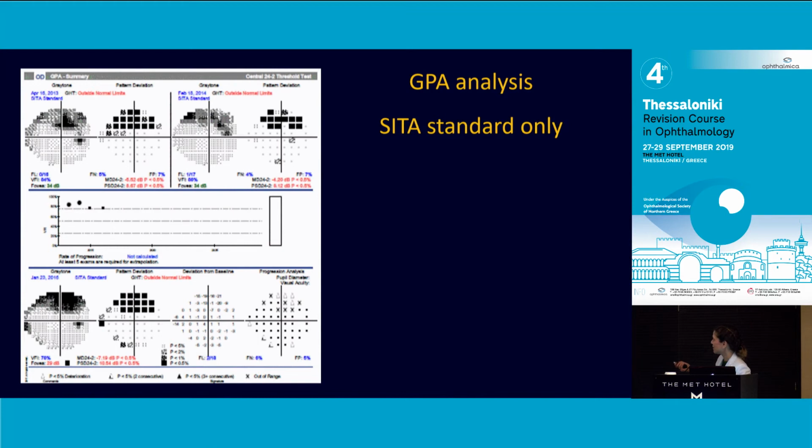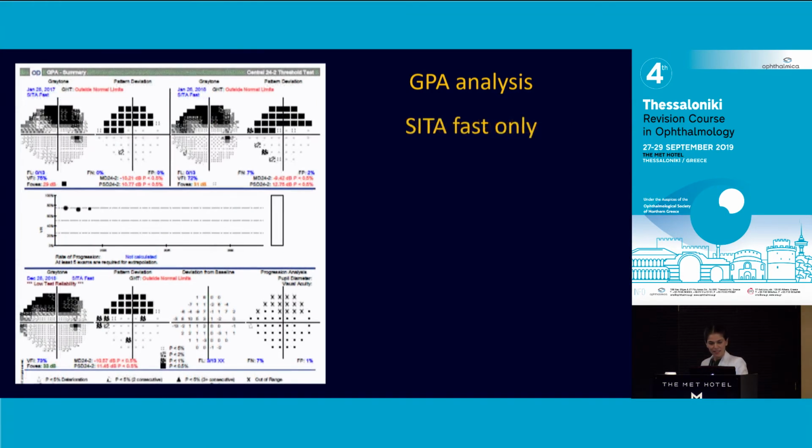So this is a relatively flat line here, nothing highlighted when I separated the fields, and again, nothing here. The patient, though, because of her family history, was saying, I'm getting worse, my vision is getting worse, and I was a little bit affected by that. I didn't do anything, but I decided to watch her a little bit more closely, because somehow I just didn't like how the field looked. But this is an example of how useful this can be. So this is my first case.